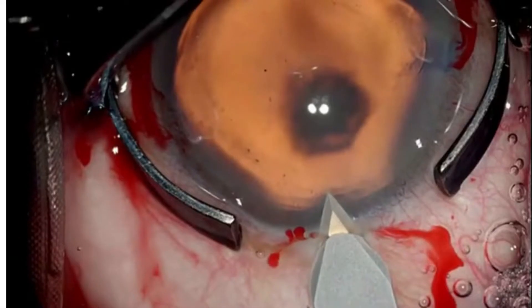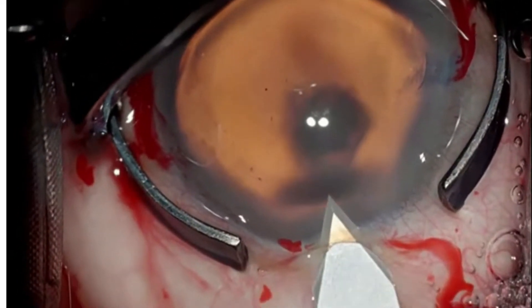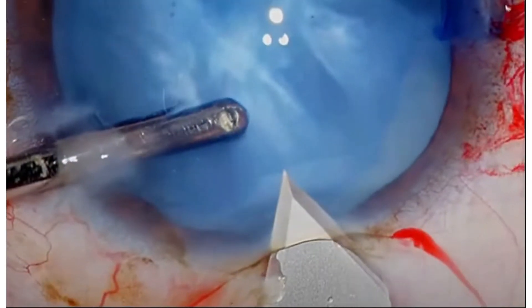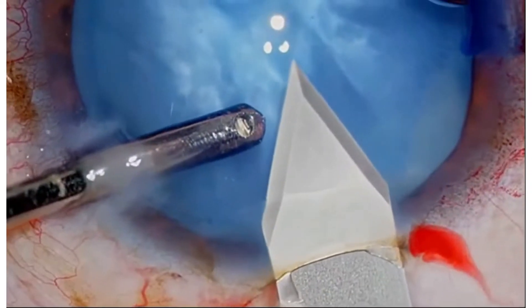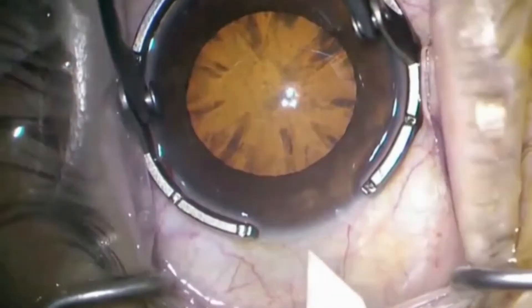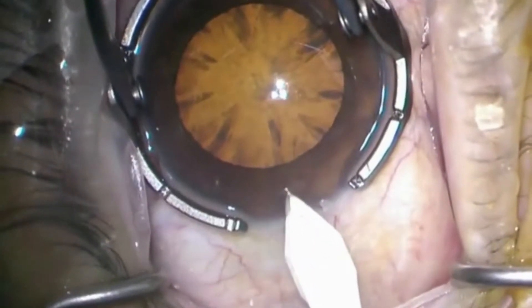The bevel position — facing up, down, and double bevel — options are available. The bevel-up configuration assists in preventing early penetration into the anterior chamber. The dual bevel configuration prevents chevron formation at the internal opening of the incision, which can interfere with wound apposition. The bevel-down configuration helps in preventing a very long tunnel, which makes movement of the probe difficult.